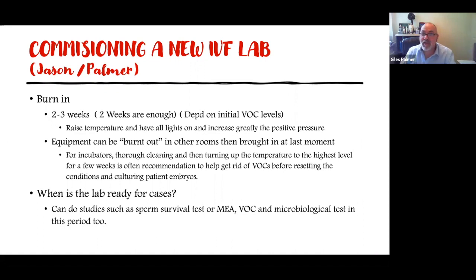If I could add on for that, yes. These are in the ideal situations, and with all the measures which we've said today, and the books you'll read, and the consensus, 2 weeks under ideal conditions should be okay. But we don't live in a perfect world. We all have the pressures of a business, of course, to open up. The only thing I would recall was that you have to be on site all the time.